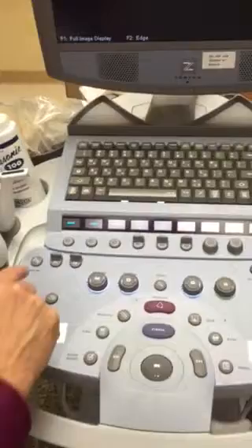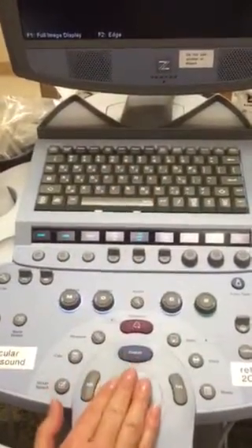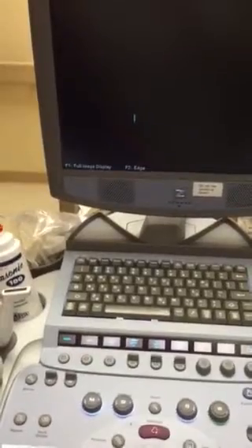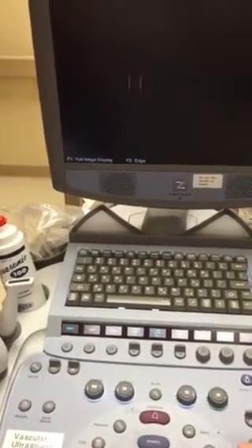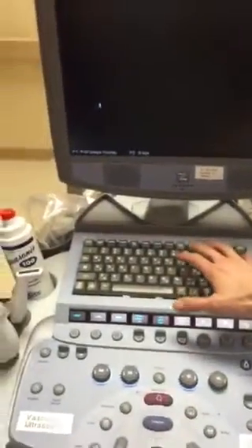Can you move it around the screen? Yes, you can. So you've got your text, and you can now move it to wherever you want it. Just hit set wherever it lands, but it'll automatically come up to the top. It's going to go to home automatically.